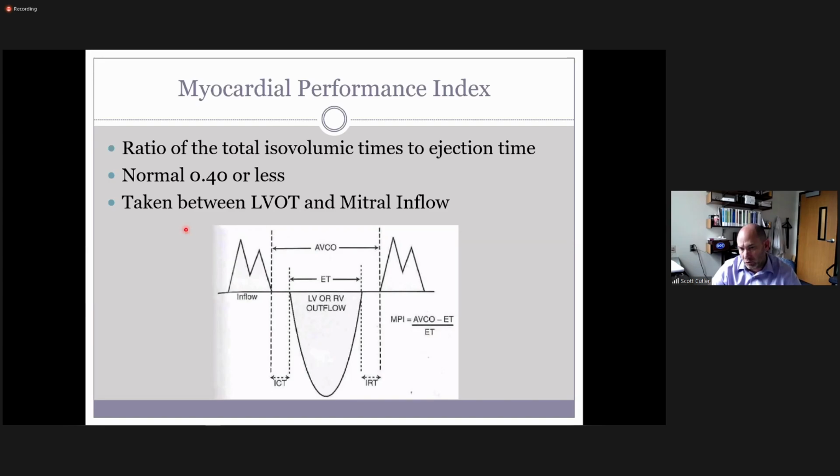And keep this in mind when you're scanning: if you really think that something's going on and you're splitting hairs with your other numbers, and you want to do a measurement like this, it's totally appropriate to do it. Sometimes I'd tell the patient, I just need to go check some pictures real quick, just to make sure I got everything. Don't get them worried about anything, just let them be safe and stable there. You can go out to the room and check the book, check the numbers, whatever you need to make sure that you have what you need. But you want to make sure you have what you need before you finish the exam. Now, in a hospital situation, that could be a little bit different, because you might be in the ICU or somewhere else.